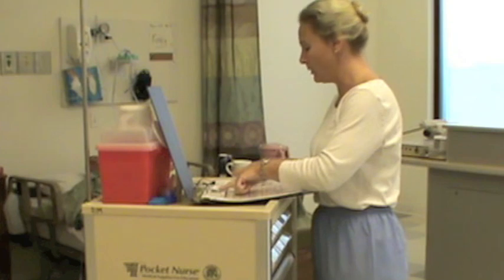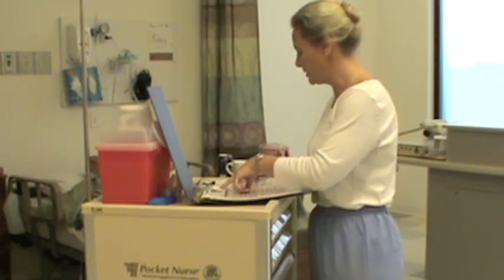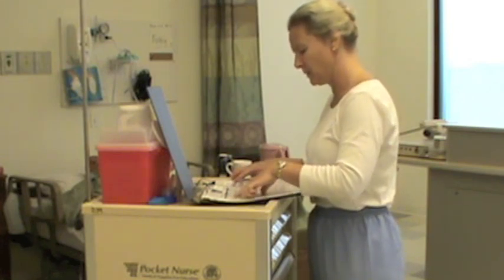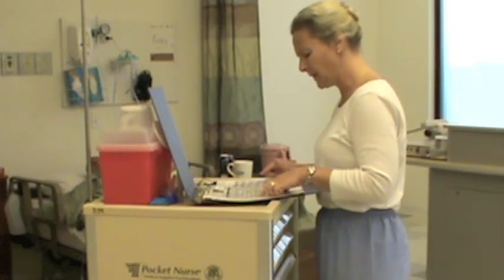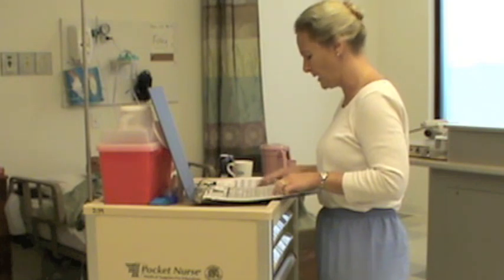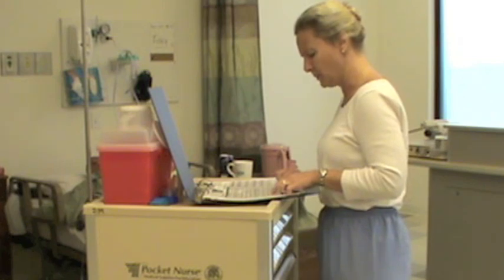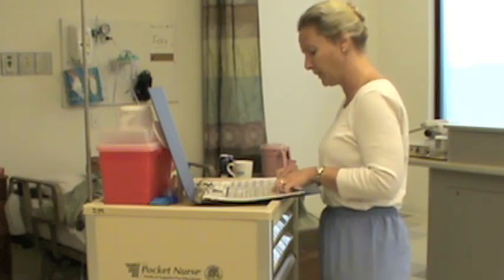I have Hoshi Ito, medical record number 589-135-1323, date of birth 3/21/1950. He came in to the telemetry unit following an exploratory laparoscopic appendectomy. He is NPO and receiving IV fluids. The order for his IV fluids, as documented on the IV flow sheet, is 0.9% sodium chloride at 125 mL per hour times 3 liters.